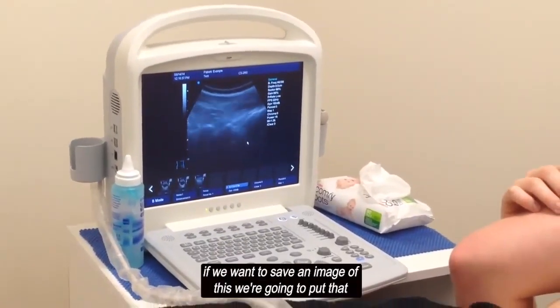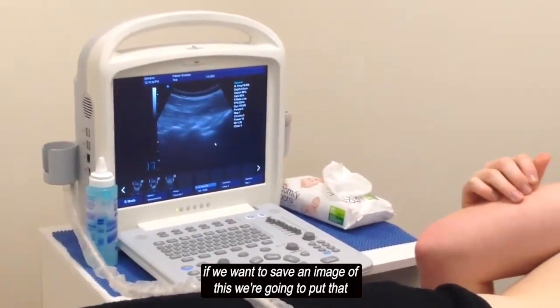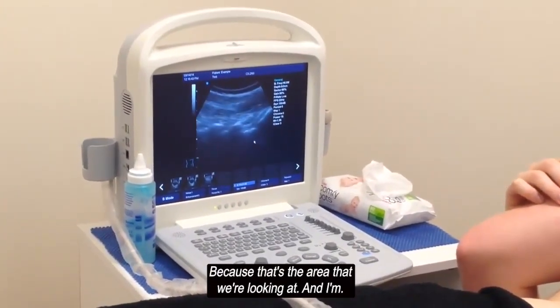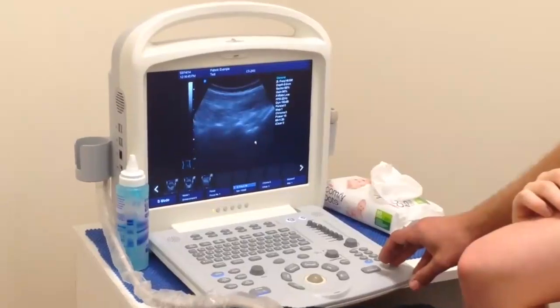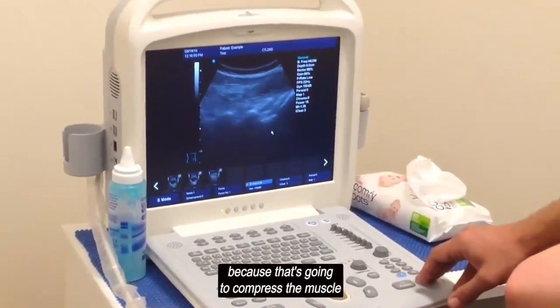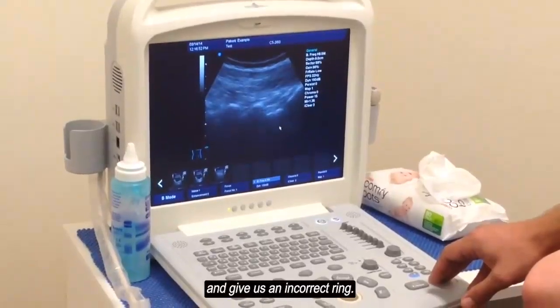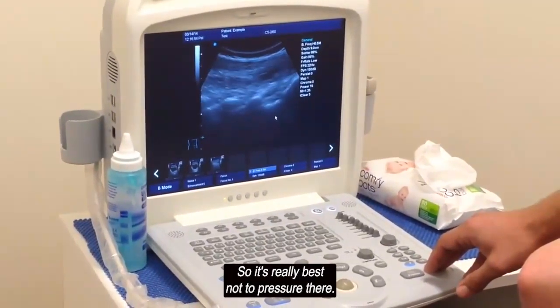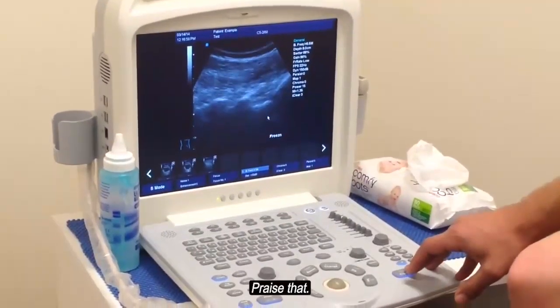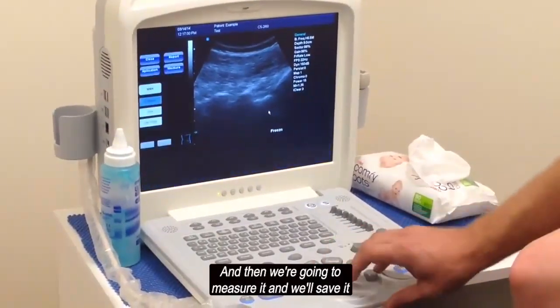Okay. Now again, if we want to save an image of this, we're going to put that L4-5 right in the middle of the screen, because that's the area that we're looking at for the moment. We're going to make sure that we're not putting too much pressure on the probe, because that's going to compress the muscle and give us an incorrect reading. So we just really back off the pressure there, get a nice image, and we're going to freeze that. And then we're going to measure it, and we'll save it.